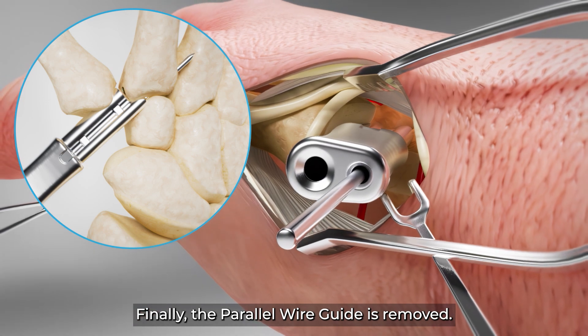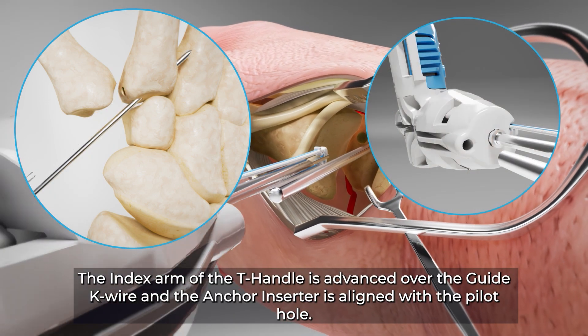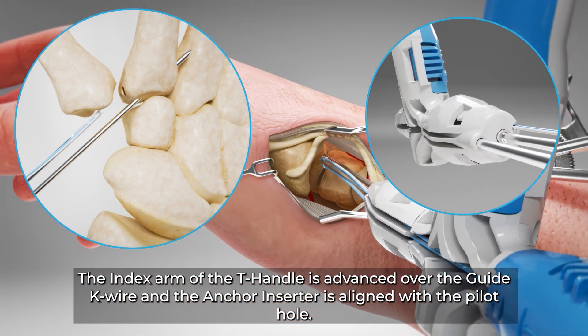Finally, the parallel wire guide is removed. The index arm of the T handle is advanced over the guide K wire and the anchor inserter is aligned with the pilot hole.